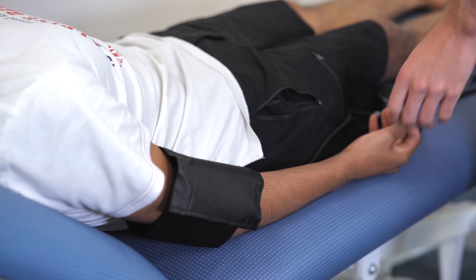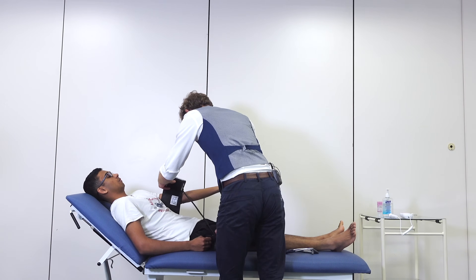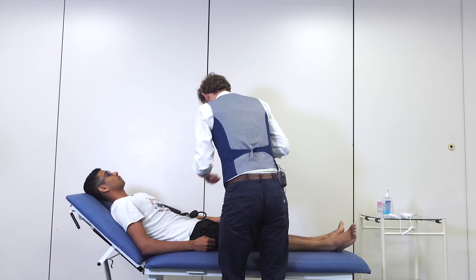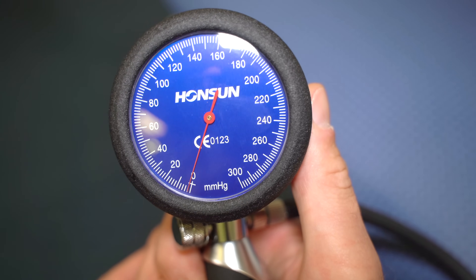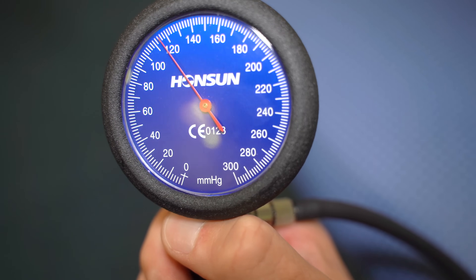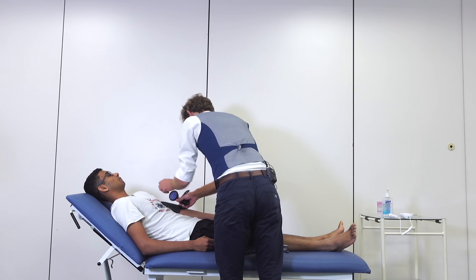So we're going to compare again on the opposite side. We've got a rough idea of where your blood pressure is now, so we're going to take the blood pressure using the stethoscope. So if you relax down. Okay, so it's 100 over 60. Bang on the dots. Let's take that off.